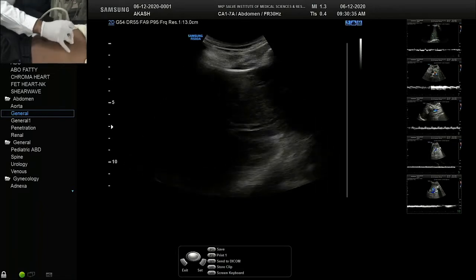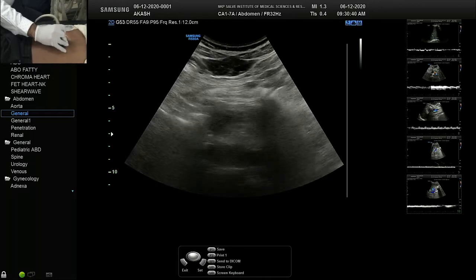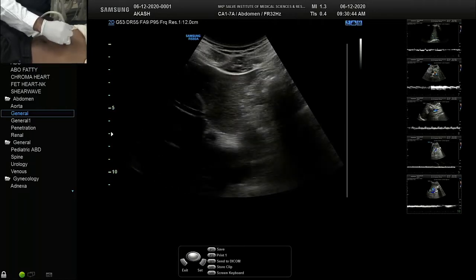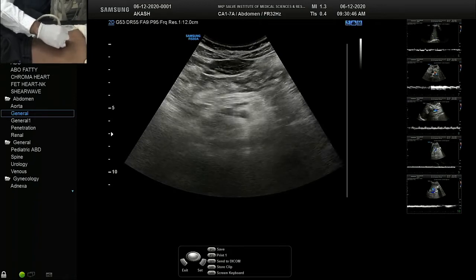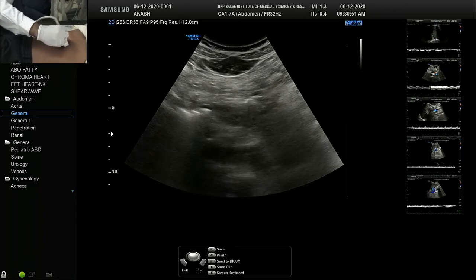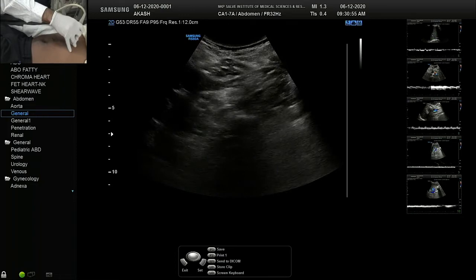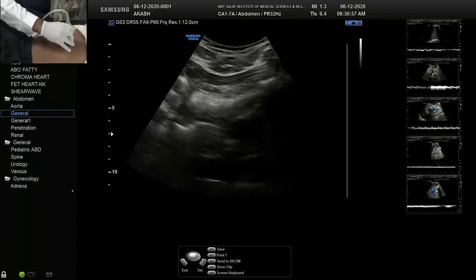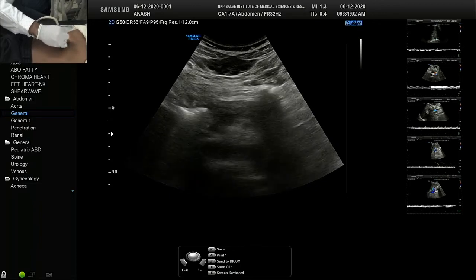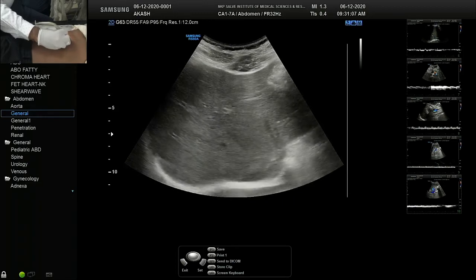The bowel gas in the epigastrium is a hindrance many a time for doing portal Doppler. It is seen in many cases of portal hypertension that they have a little bit of distension, or due to ascites the bowel loops come up, and visualization in the epigastrium is sometimes difficult. So we can try to see via the left lobe of the liver, or definitely the patient is asked to come NBM to see whether we can see that.